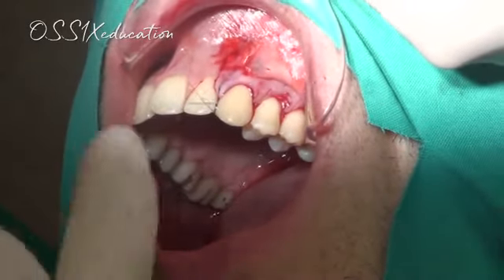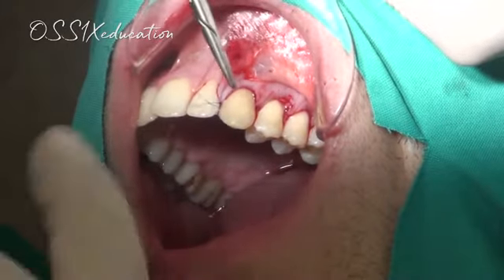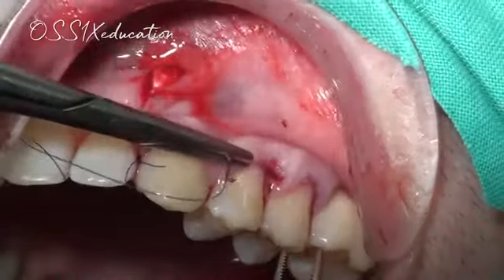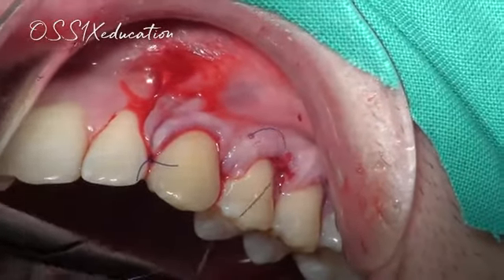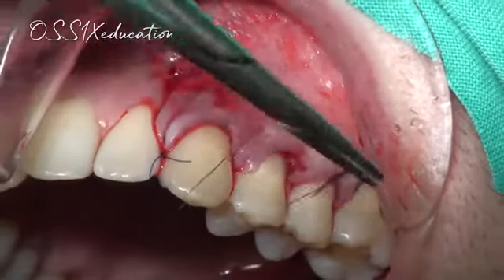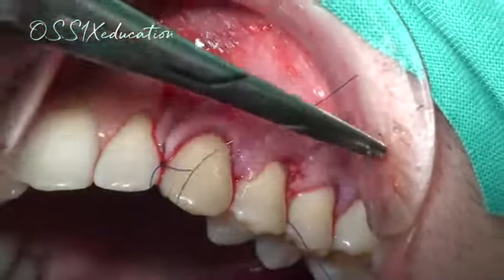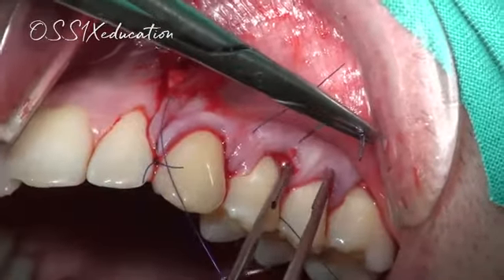Some like to do sling sutures, that's fine. What I notice is that I quite often have to additionally add a single suture when I do a sling suture. Sometimes it works perfectly, but sometimes you do have to add, let's say, a 6-0 suture. So, okay, let's see. Here we can do a sling suture. You go from the buccal.